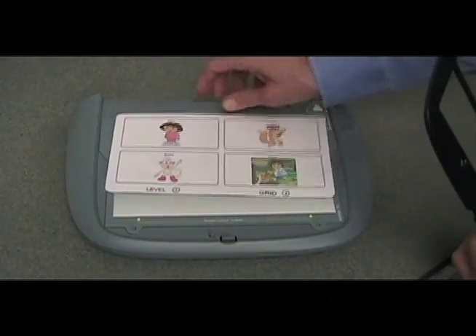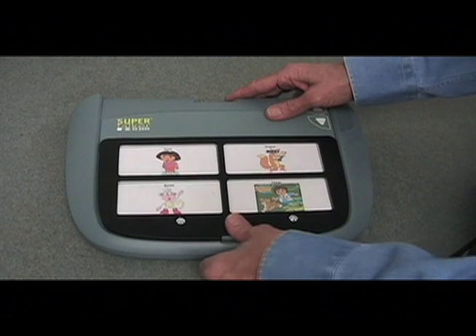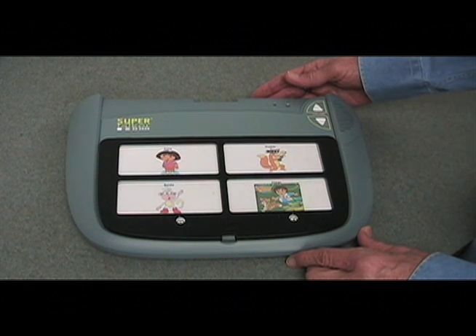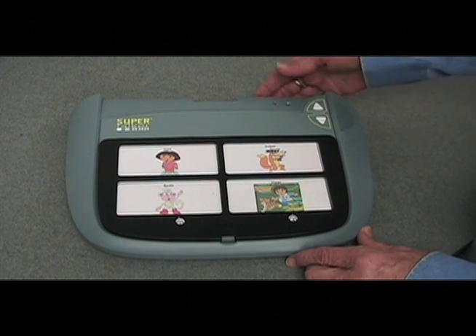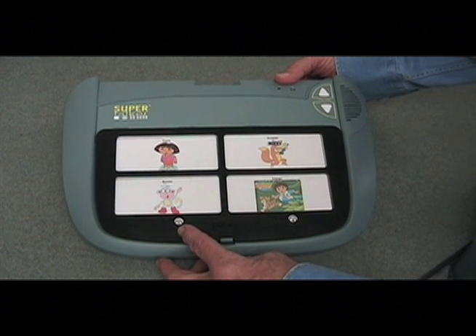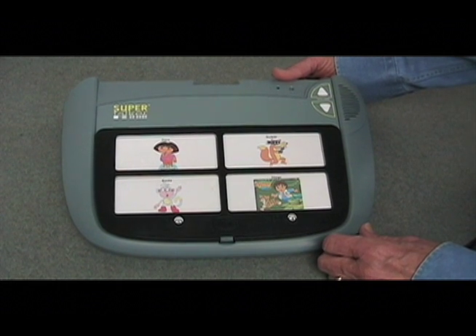The front of the SuperTalker is where you put your overlay and the grid that corresponds with the overlay you're using. Templates for the SuperTalker overlays can be downloaded at the AbleNet website. This particular overlay was made with BoardMaker and pictures from Google Images. We also have at the bottom of the overlay a place where you can see the level you recorded and the grid that you're using. That's kind of important if you're using multiple overlays.